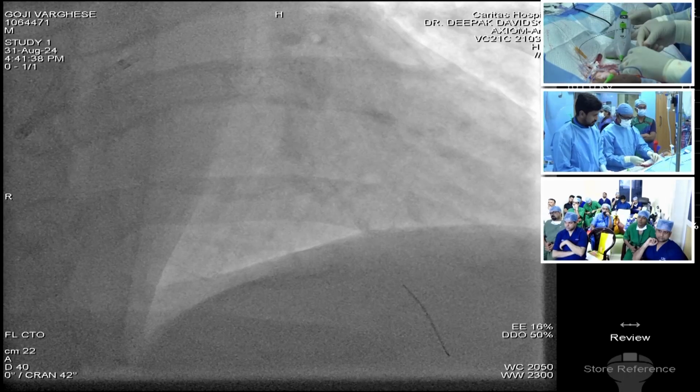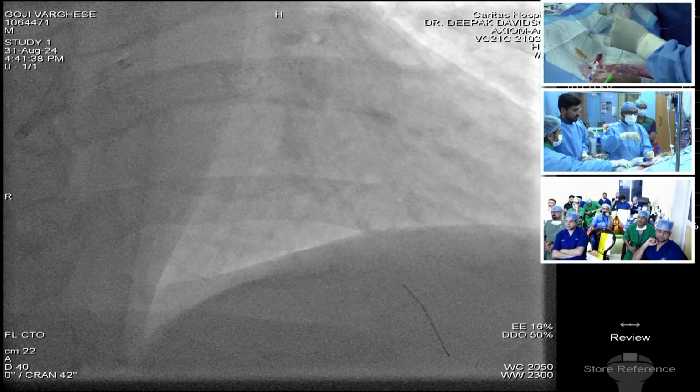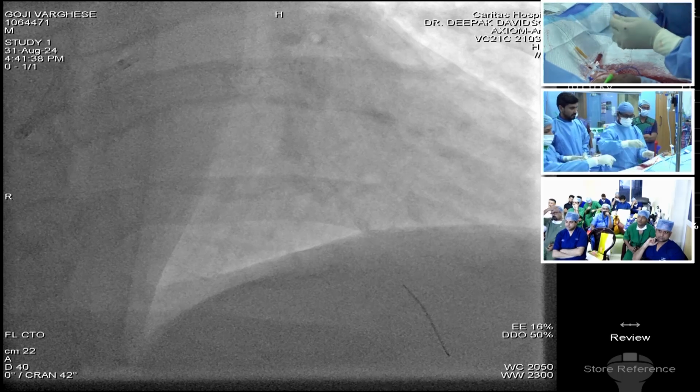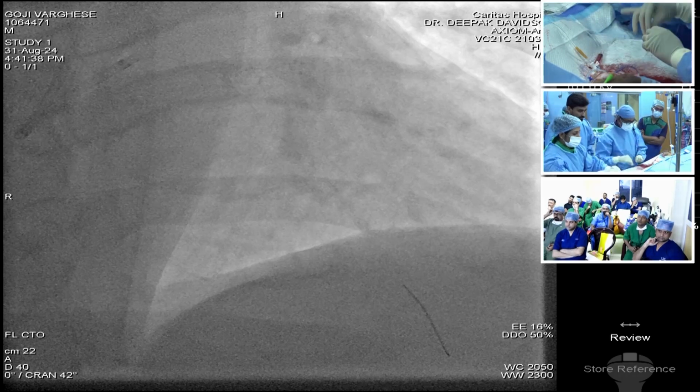Yeah. Now OCT run through wire and OCT catheter.